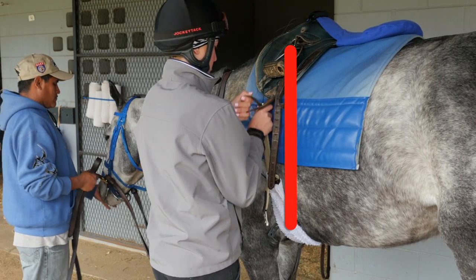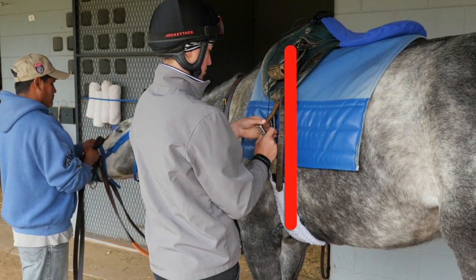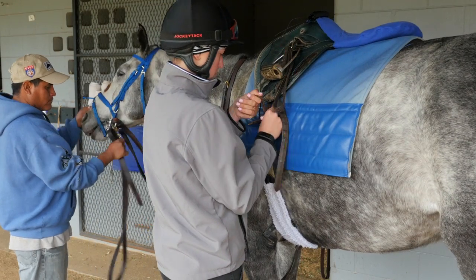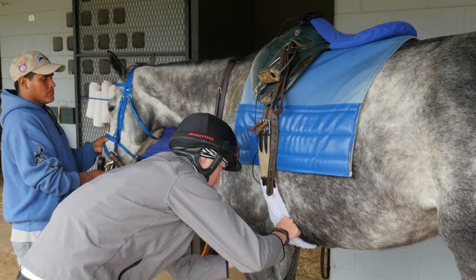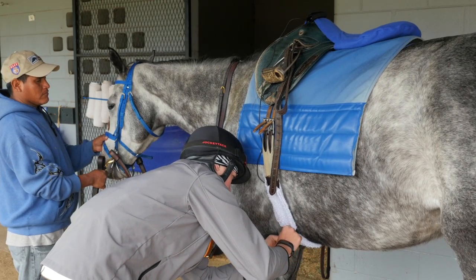The top and the bottom electrode will be pretty much in line with each other, and then she takes the rubber bit and ties it around the outside of the girth to keep it in place.